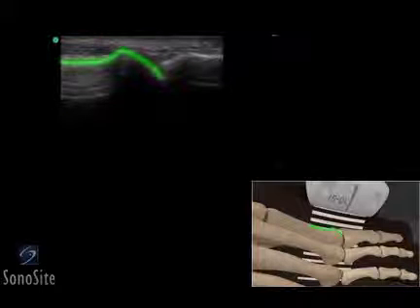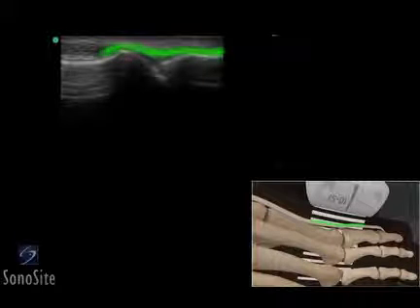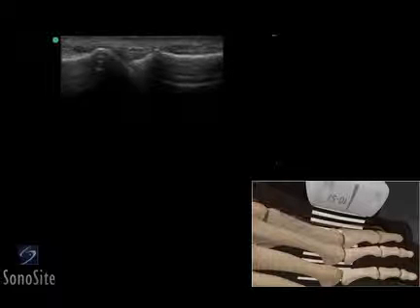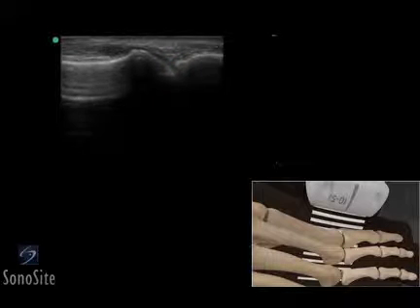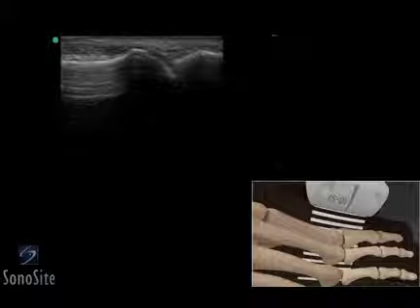The metatarsal head is seen as a bright hyperechoic rounded structure. The proximal phalanx can be seen as a hyperechoic linear structure just distal to the metatarsal. The extensor tendon lies above the bony structures and appears as a hyperechoic fibrillar structure. The metatarsal phalangeal joint can be seen as a dark hypoechoic region between the metatarsal head and the first phalanx.